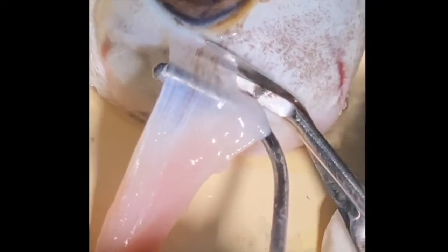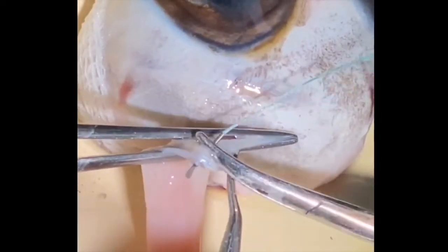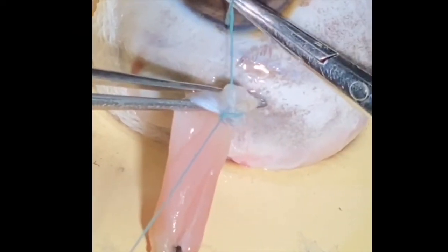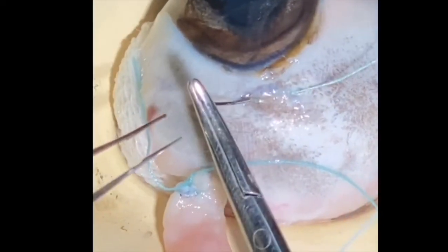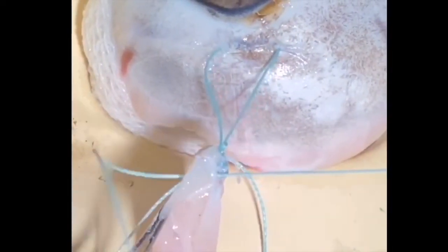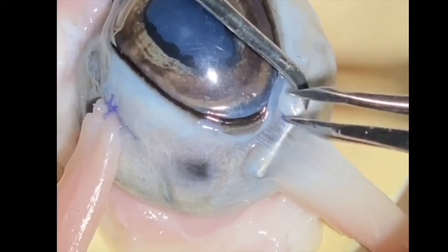For performing the superior oblique loop tenotomy, the superior oblique muscle is disinserted. The loose end is secured using a 5-0 ethibond suture and scleral pass is taken through the insertion site. The suture is again passed through the free end of the muscle, leaving behind a loop of approximately 8 to 10 mm in length to complete the loop tenotomy of superior oblique.